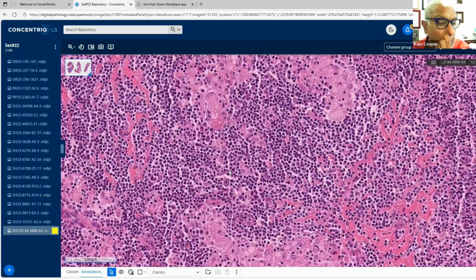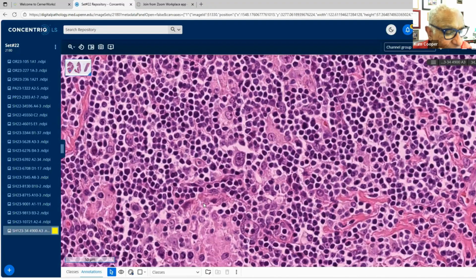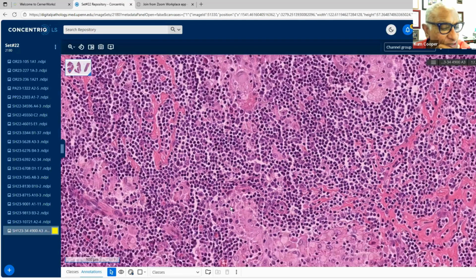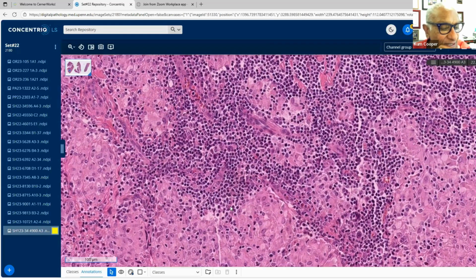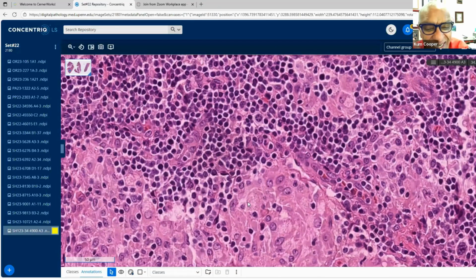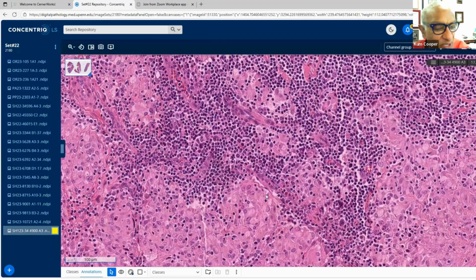Those are good. HHV, I like that. Nozuko, yes, I like that. My good friend in Cape Town showed me a very nice case recently with HHV8 viral inclusions that was referred to him as a potential malignancy. I'm forgetting the location, but he showed me a nice one. This is not that, but I did not do HHV8, and I don't have that marker. But the one we have was positive.